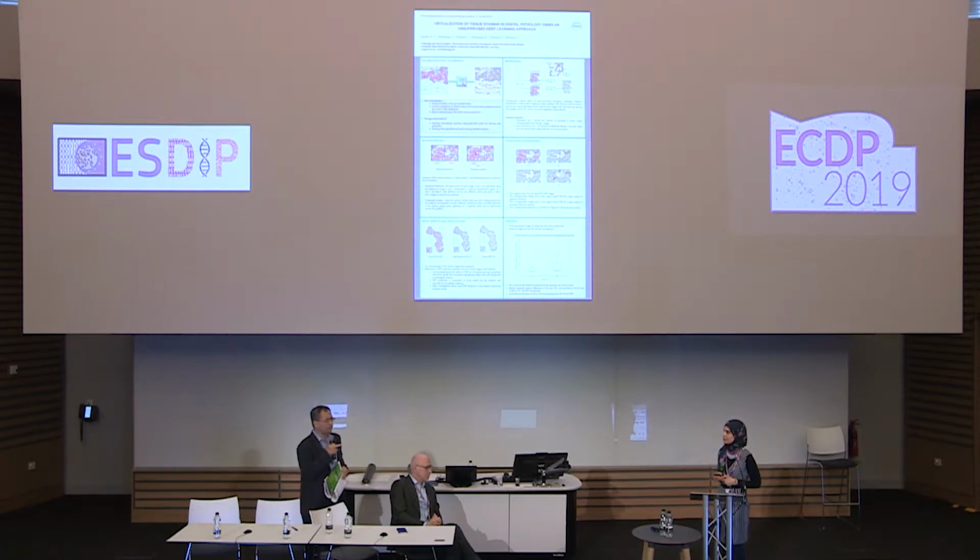So you talked about this smooth transition in this statistic. If you can expand it a little bit, just what did you mean by that? Yeah, so usually when we do the classical inference, we have these instance normalization layers, and then in the function that will be applied to the input images, we will have the mean and standard deviations of this input field of view in order to generate the output image.